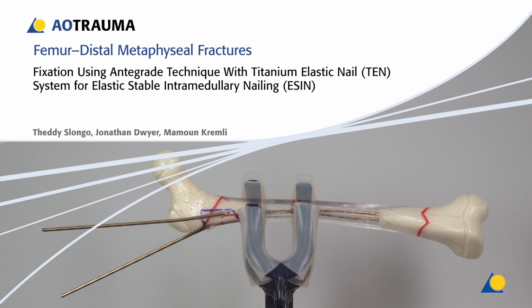The procedure for implanting the titanium elastic nail using the antegrade technique will now be demonstrated. The monolateral descending technique is preferable for fractures of the distal third of the femur or the distal metaphysis. The descending technique in the femur requires a different procedure as both nails are inserted laterally. To achieve the correct biomechanical configuration for stabilization of the nail tips and the metaphyseal fragment, one nail must be contoured and twisted differently.